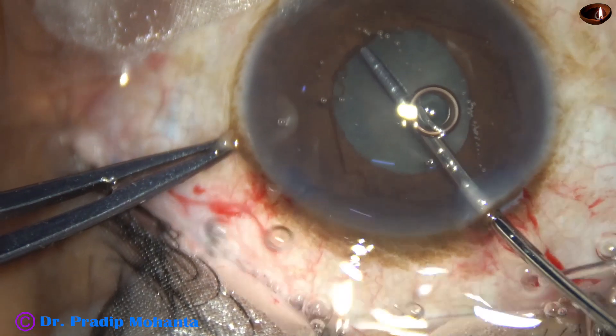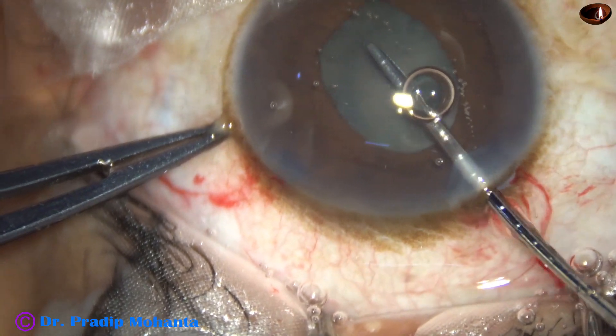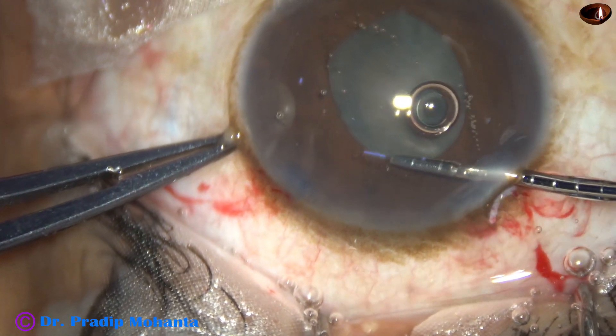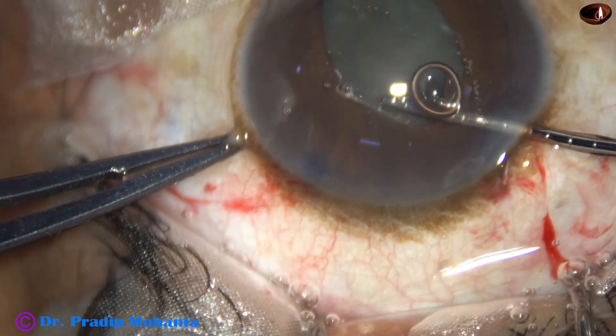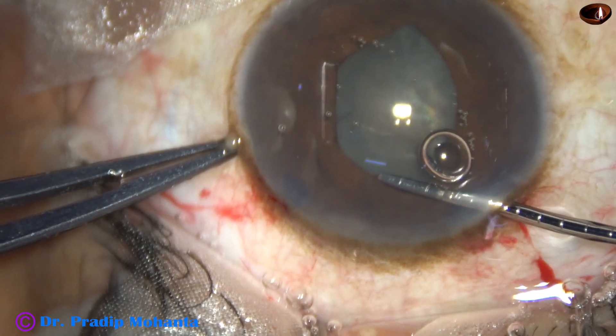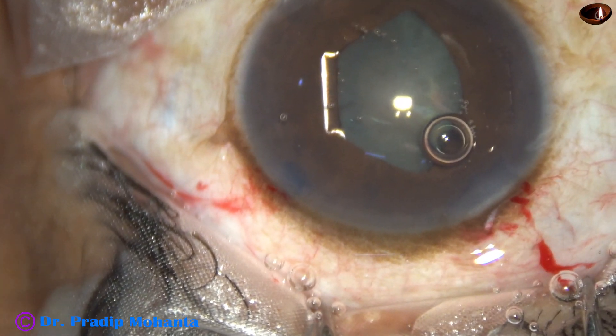The trailing flange — if it is not stuck in the main wound — the leading flange is tucked under the iris at one go. Now I tuck the flange on the left side, which is directed towards 1 o'clock. Now inject visco.